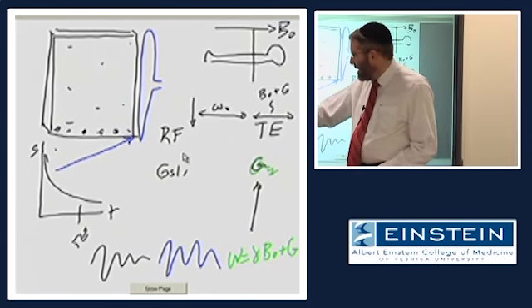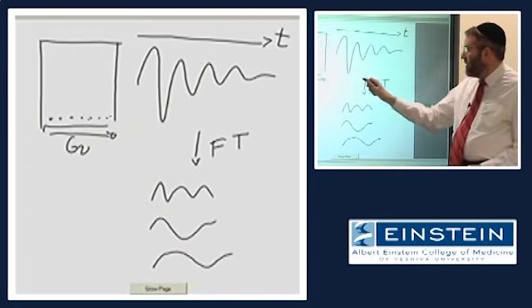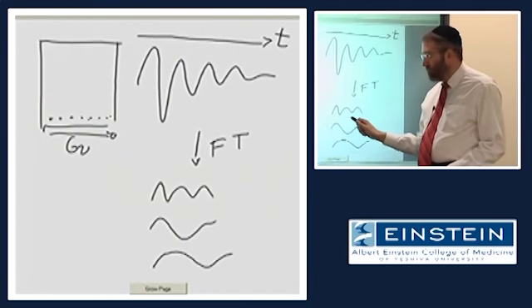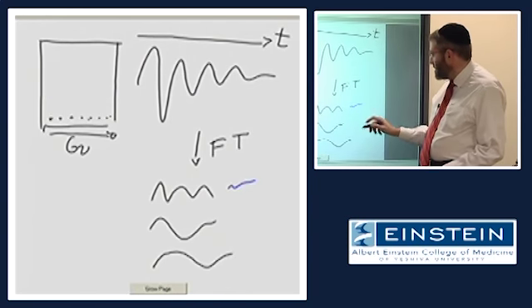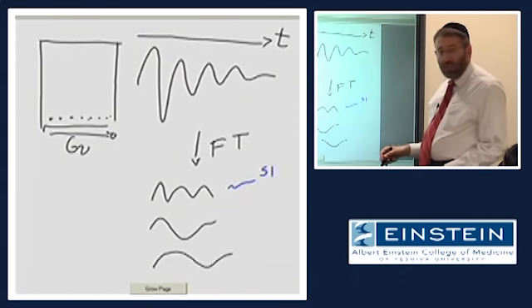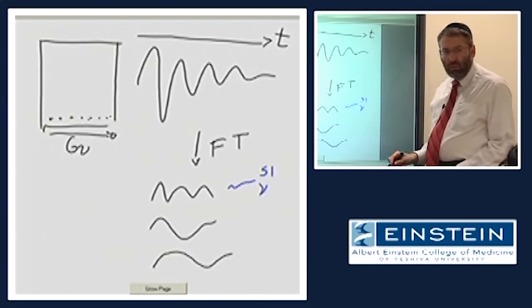And we've said that we can take that composite signal and, using the Fourier transform, decompose it into those components. Right? Each of these has two features. One is a signal amplitude, and one is a frequency. Right?